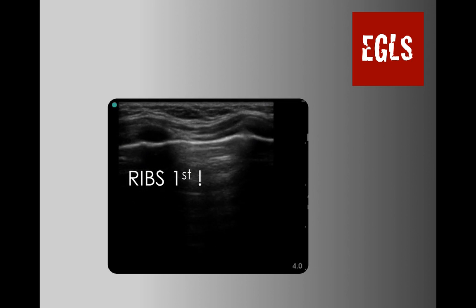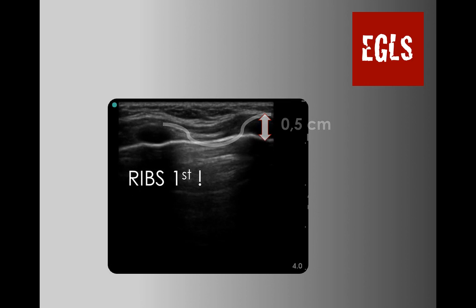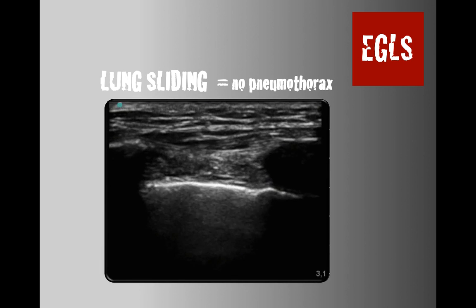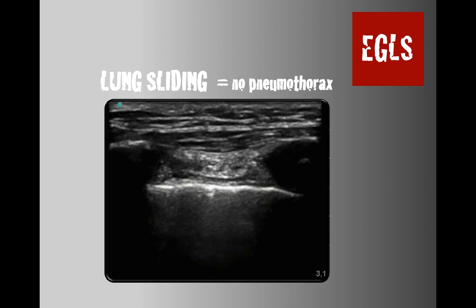So we have another example right there. Find the ribs. Make sure you look roughly 0.5 centimeter behind the ribs. You find the pleura, bright echogenic. So ribs first. Always. If we have a crashing asthmatic patient, someone on a vent, or who's been in a car wreck, really this is the fastest, most accurate thing you can do at bedside to rule out a pneumothorax. Seeing lung sliding guarantees you 100% that this patient doesn't have a pneumothorax under the area you're probing.